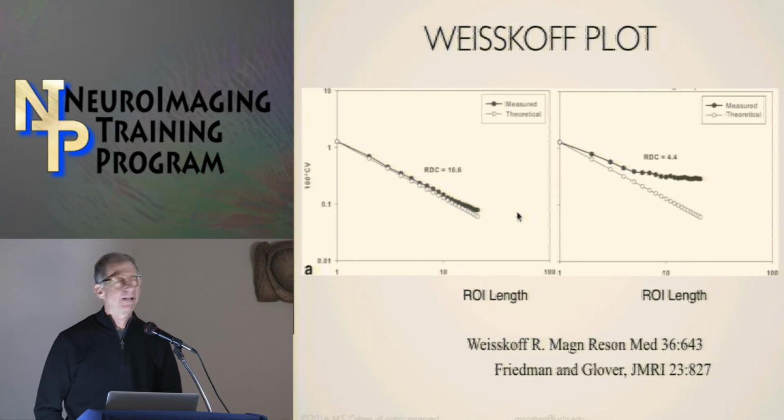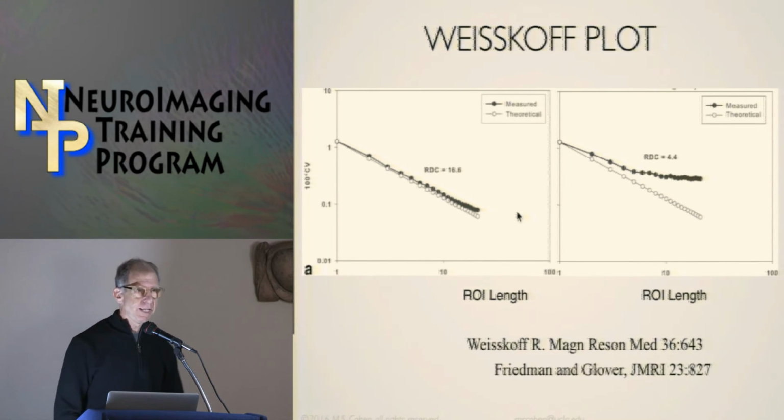Unfortunately, they have many reasons for it, but unfortunately for us, their implementation of the pulse sequences is going to differ. So the specific timing of the gradient pulses, although there's this general idea of slice selection, phase encoding, readout encoding, they run the ramp time getting up to the maximum value at different rates. For the diffusion scans, the shapes for the gradients used for the diffusion encoding differ quite a bit across scanners. And these things have significant, although sometimes subtle, effects on the pictures. So it's not easy.